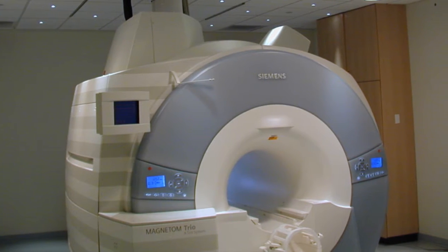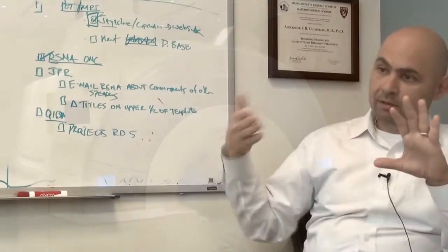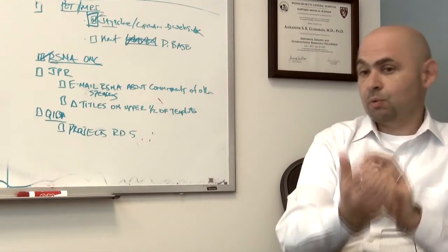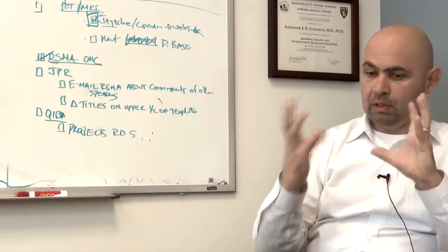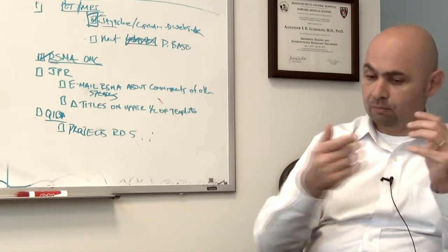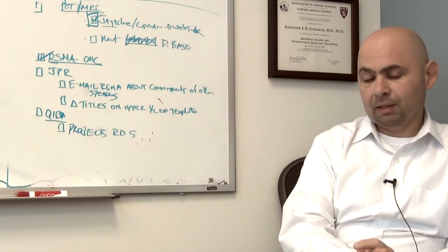table, right? Because we put it in the MRI machine. In the MRI machine, the coils are going this way. The table is the long axis. That's the Z dimension, and that's where the fringe fields are around the MRI machine, and the table is essentially the long axis. So that's your B0. B0 is the nomenclature of the static magnetic field.